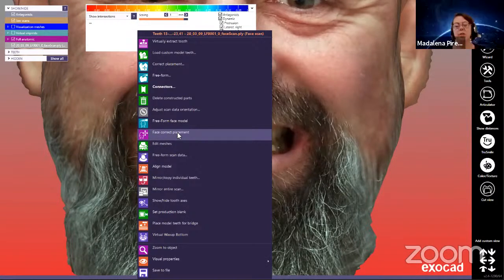There are now certain devices, for example, like the Carestream CBCT, the latest, the 9600, that offers a face scan while you do the CBCT. And most people in dental right now are using apps and things that they can add to their tablets and phones so they can quickly scan the patient.